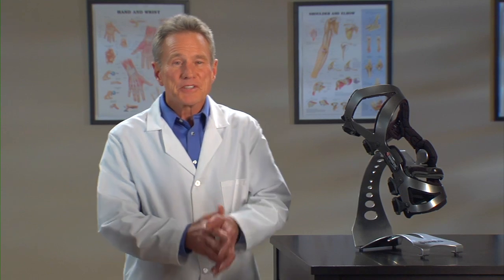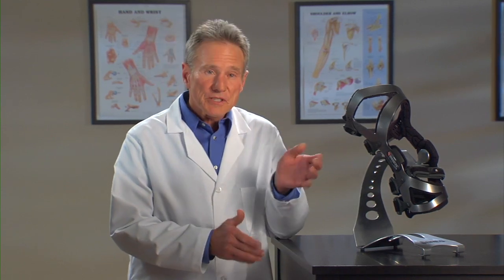Hi, I'm Jim. I'm here to tell you about the brace chosen specifically for you and your condition. It's from Bregg and it's called the LPR knee brace.